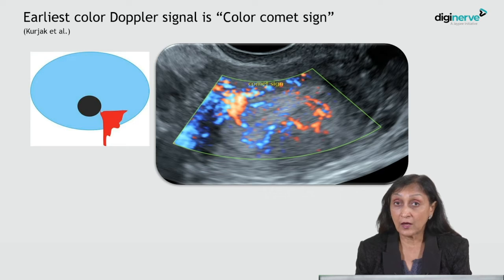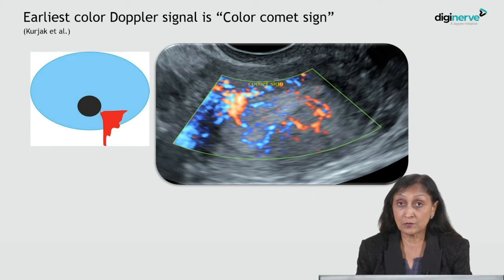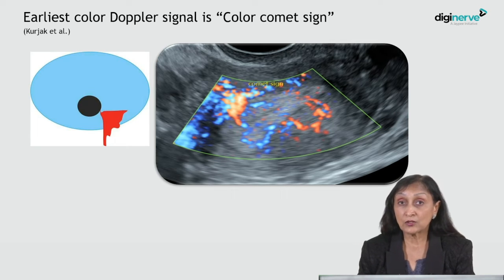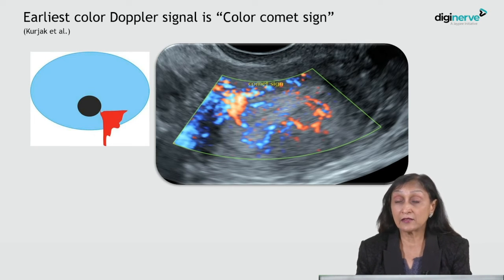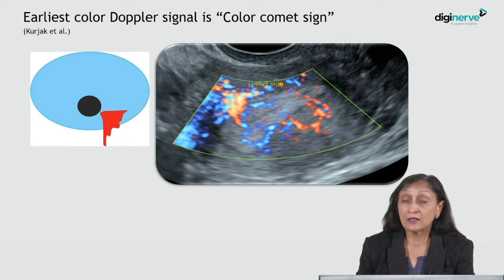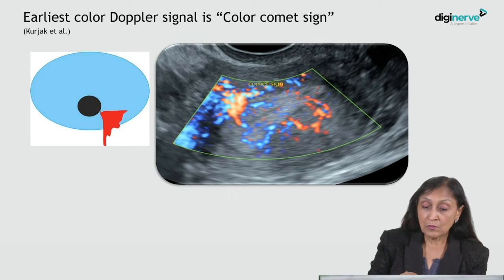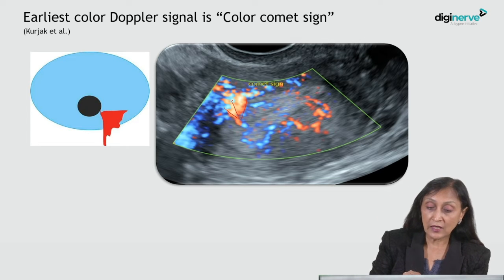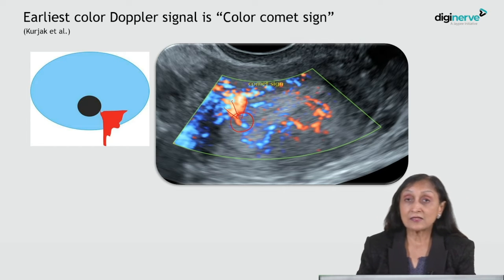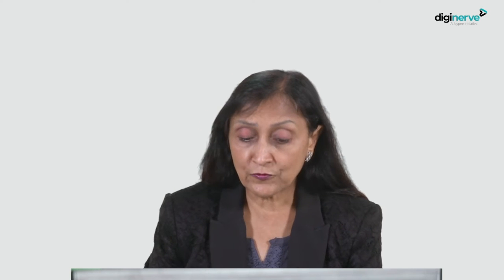The earliest color Doppler sign is the color comet sign, where the endometrium is asymmetrically thick and hyperechoic — the area where the embryo is implanting. If you apply color Doppler just after the midluteal phase, you will see multiple vessels converging at a single point. This is called the color comet sign and is one of the first signs to indicate that conception has occurred.